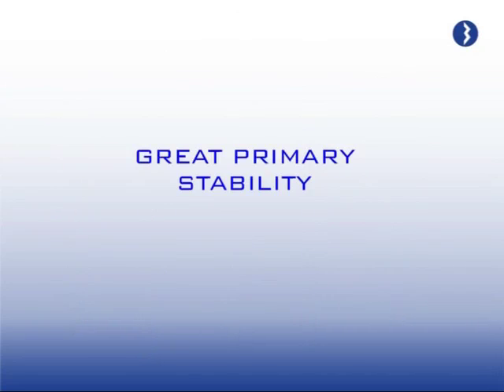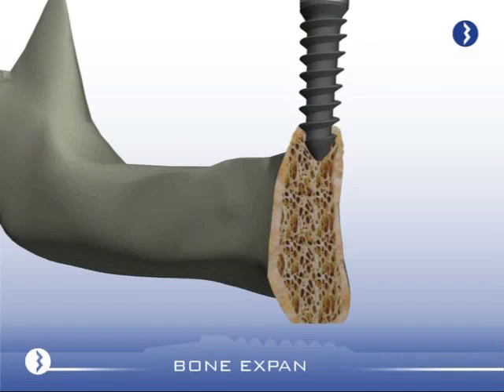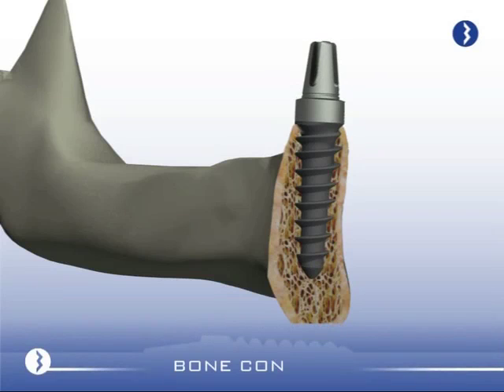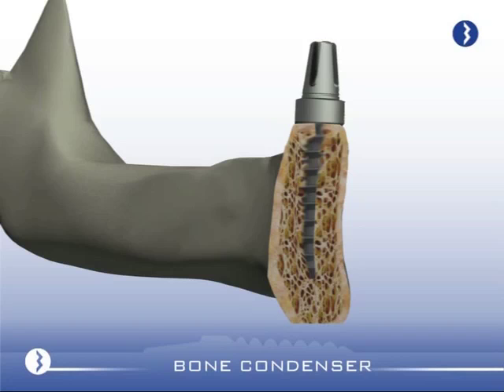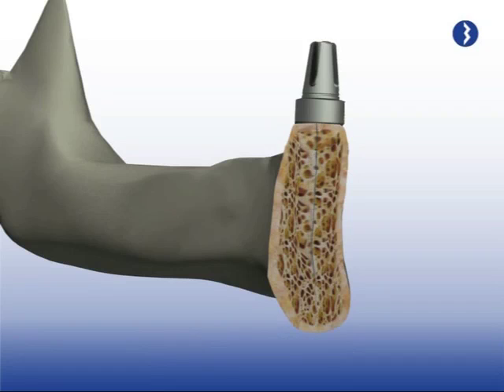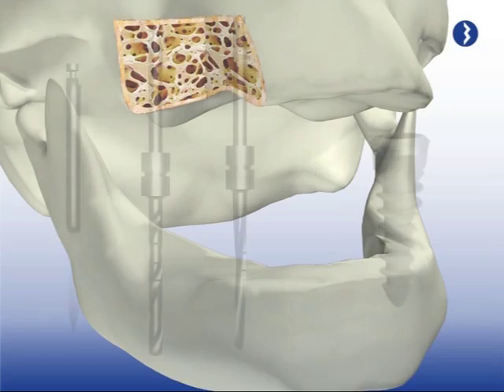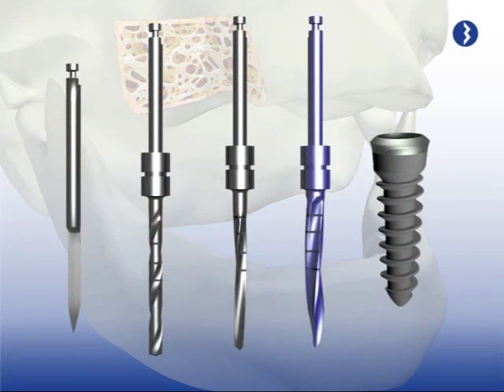To gain the best stability that characterizes the Q implant system and have the maximum benefit from the condensing and expanding properties of its coils, there are 2 things to keep in mind when drilling. In bones of lower osseous quality, spongy or type 4, we should avoid the last drill in the sequence we have stated.